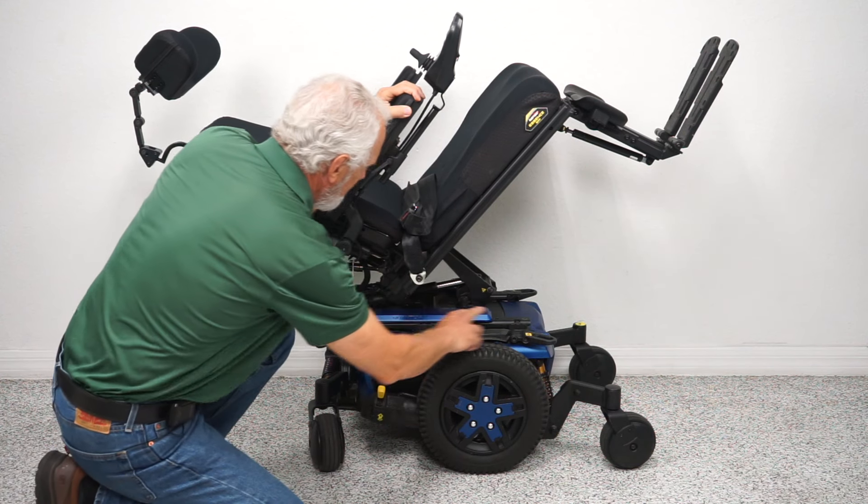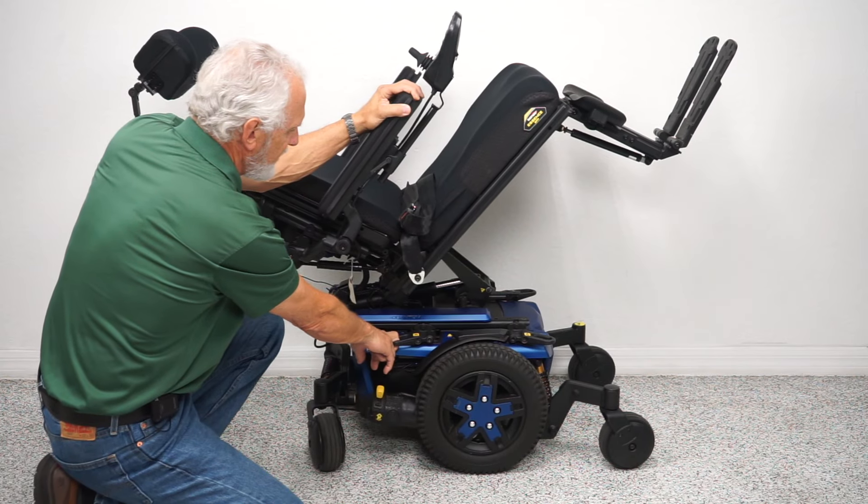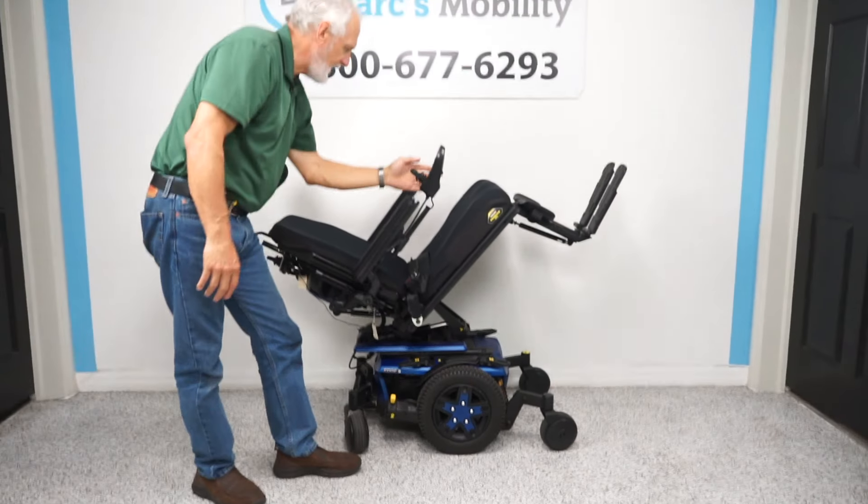There are heavy-duty anchor points — four D-rings around the chair. This is where you secure your chair if you are being transported. Let me put the seat back down.